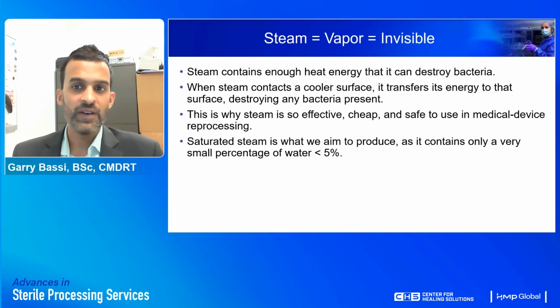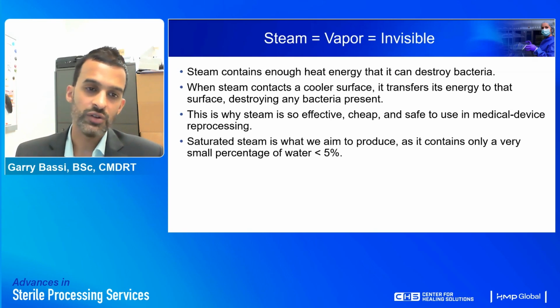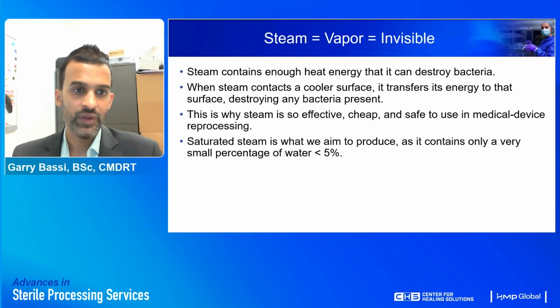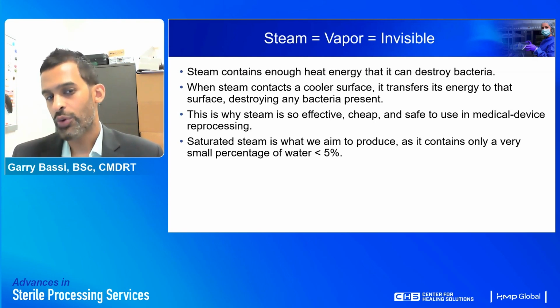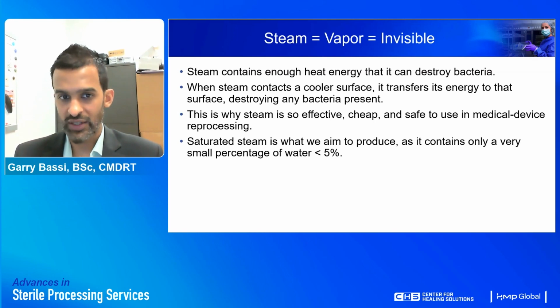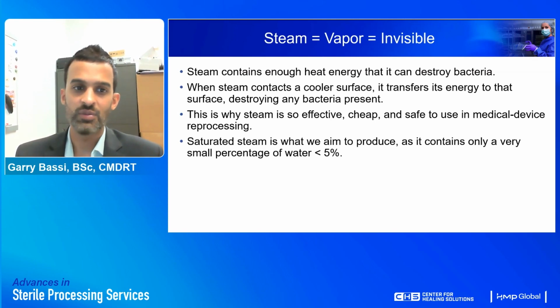Steam contains enough heat energy that it can destroy bacteria. As I mentioned earlier, it's a very powerful sterilant. And when steam contacts a cooler surface, it transfers the energy that it contains to that surface. And that energy is what destroys any bacteria present. So it's important we remember it's not the steam that destroys the bacteria, it's the energy that the steam contains.